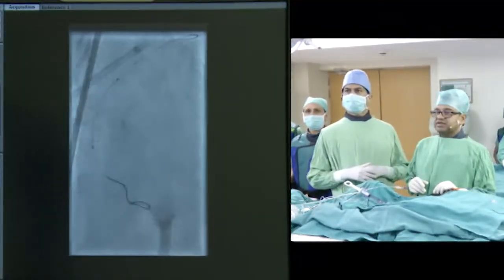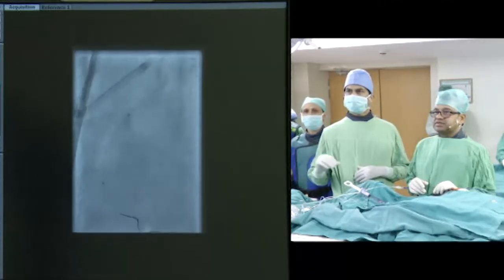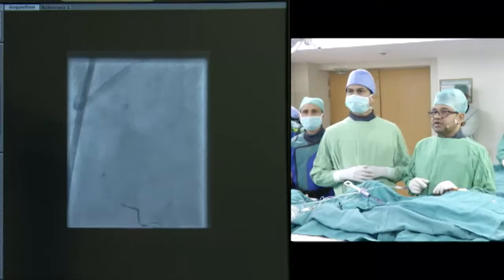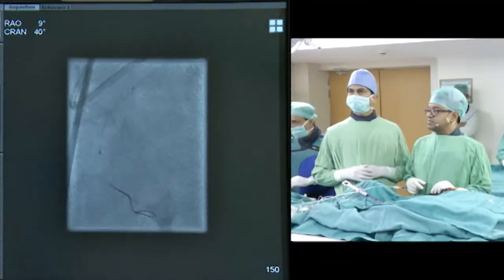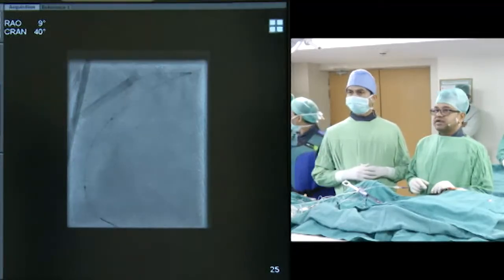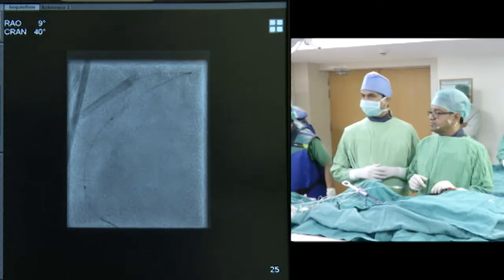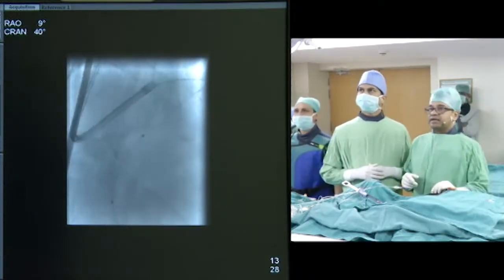There are 3 radio-opaque markers in the proximal segment and 3 in the distal segment. Can you just focus it? Remove the black portion of the wire from the focus. Focus on the stent boost, please. Is stent boost ready?